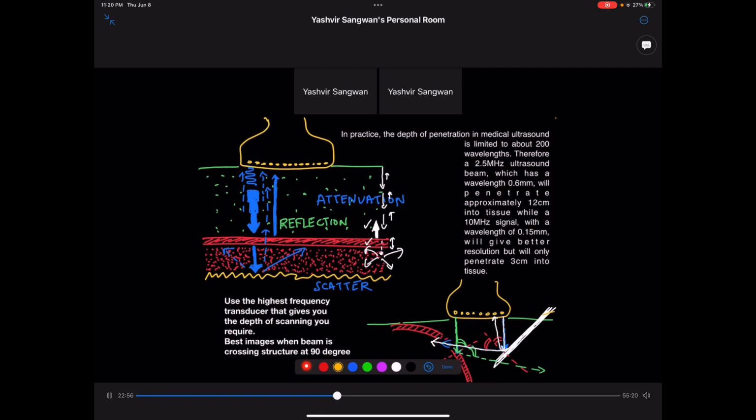Either you can have the needle come at a shallower angle, or you might push the probe down in a way that the probe is more like this. Now ultrasound will come from a piezoelectric crystal, hit the needle, come back and be registered, and suddenly you are seeing the needle.